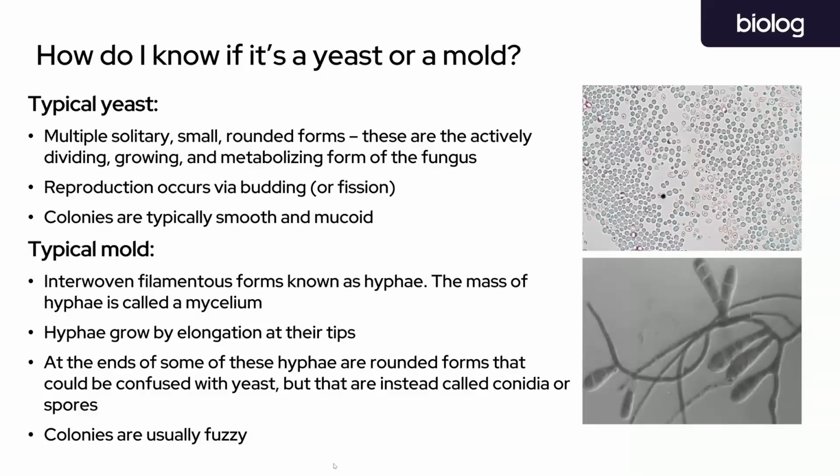Yeah, and the other big issue that is present in sequence identification is just the lack of available reference sequences, especially at the level of strain identity. And so for phenotypic ID, we don't have to worry about having the correct reference genome to compare to. We just have the reference strain. And then as soon as that profile is captured and added to the database, it can then be used just like that for future identification efforts. Yeah, that makes sense.